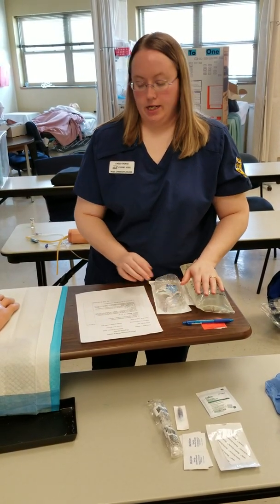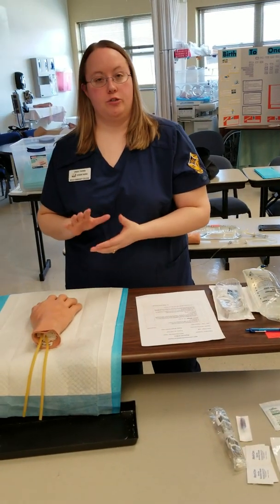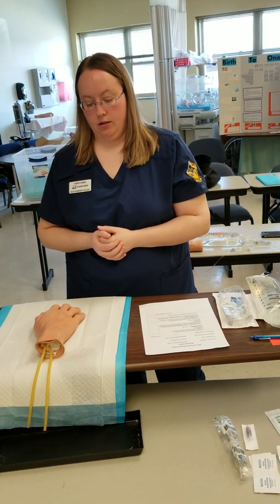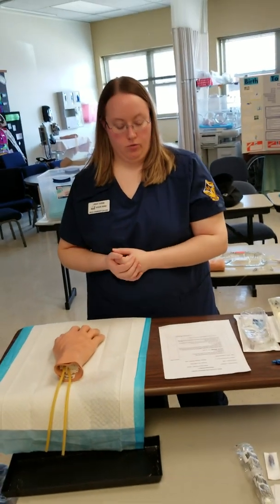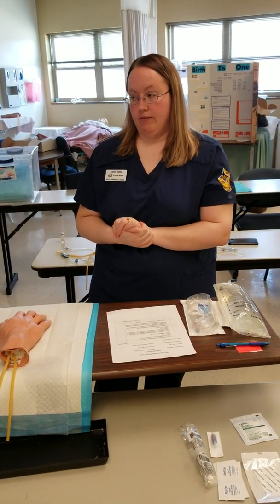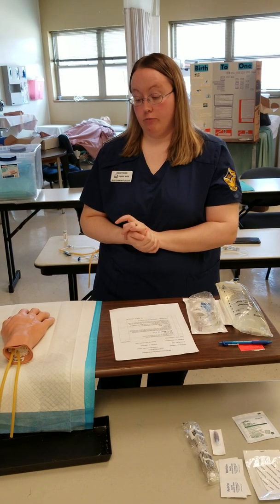So then I'd go ahead and enter my patient's room. I would first off introduce myself to the patient. My name is Lindsey Thomas. I'm going to be your nurse today. Your provider has ordered an IV to be placed to rehydrate you with normal saline. And so that's what I'm going to go ahead and do. I would identify the patient by 2 identifiers, their name and their date of birth.